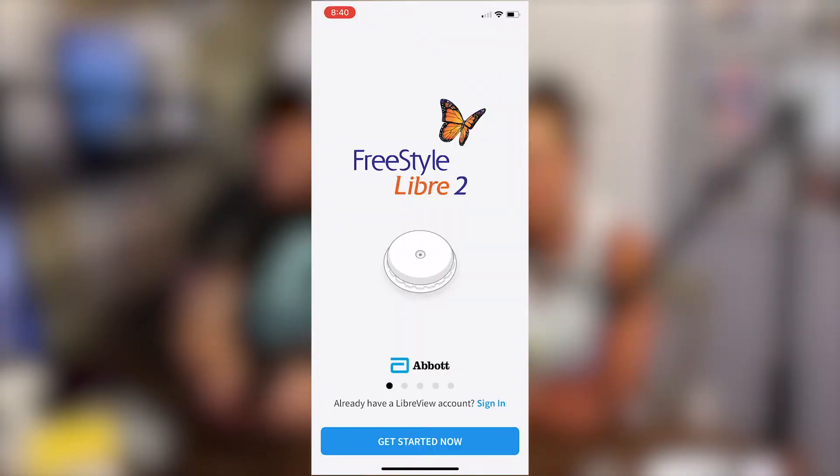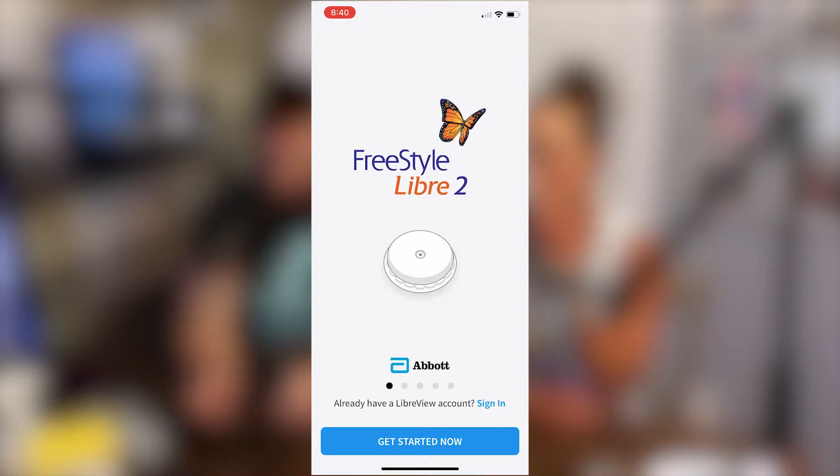It's ready to go. It's ready to use your reader or the app on your phone to scan, and you'll see it calibrating the new sensor. After that you can check your blood sugar as much as you want. Once you get your app pulled up on your phone — there's also the Freestyle Libre 2 reader you can use, but since we're tech savvy around here, we're going to use the app on the phone.